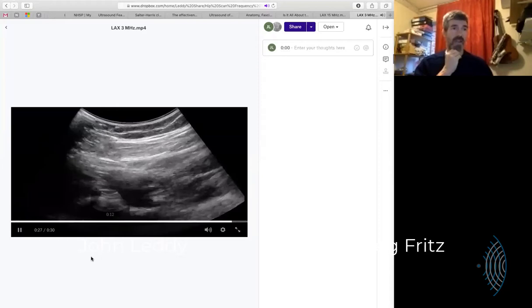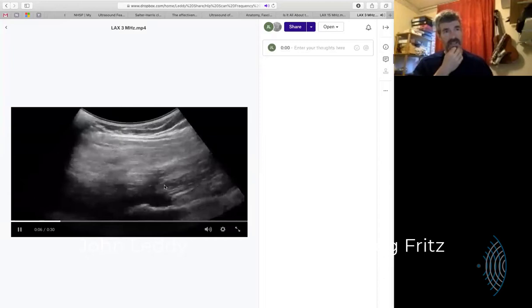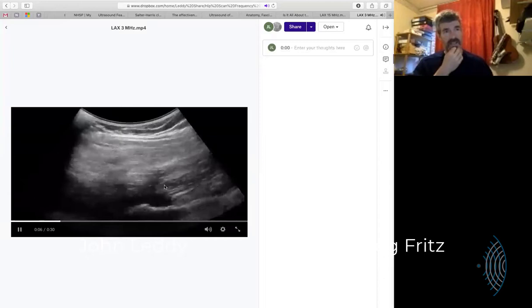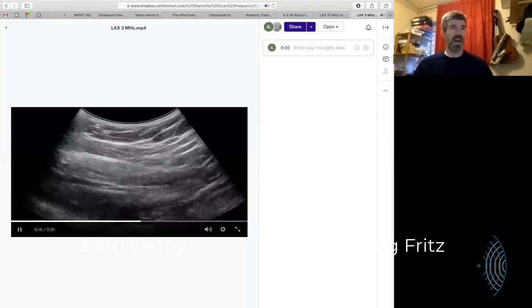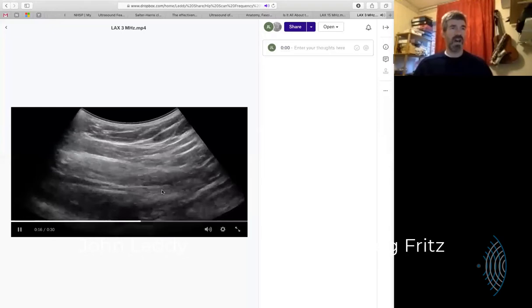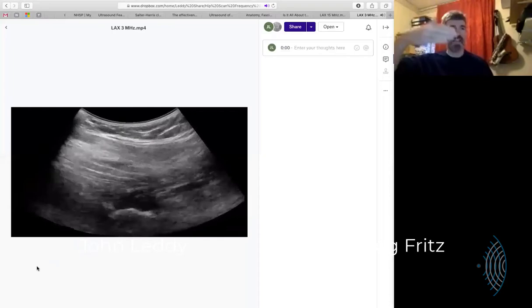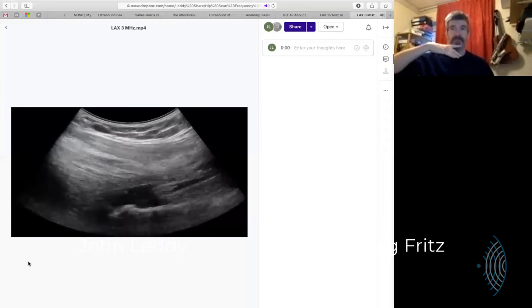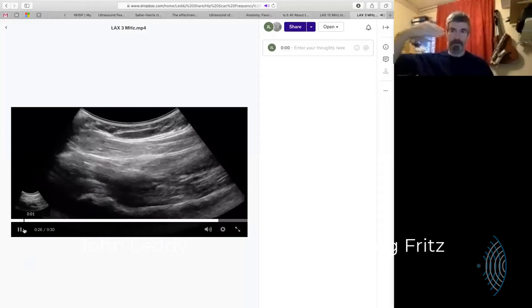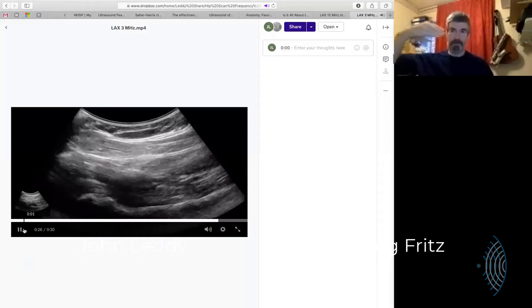This area looks dark and makes you think there might be an effusion there. But actually as you're passing through the area, that darkness is moving away in all sorts of directions — we're not really sure whether that's an artifact or not. As we come back to the head, as you're transiting across it, you get the sense that you're not actually going around the head at the same time. So I'm not keeping the head as my objective and making an arc perfectly on the head — I'm actually slicing it and translating lateral to medial as a topographical slice. Yes, that's the impression I'm getting.